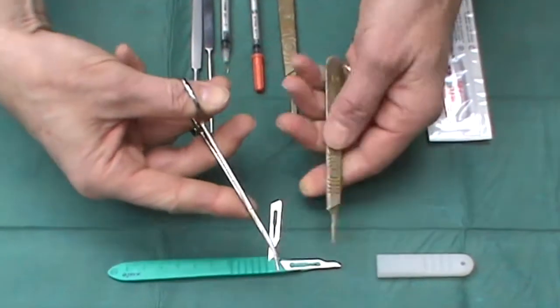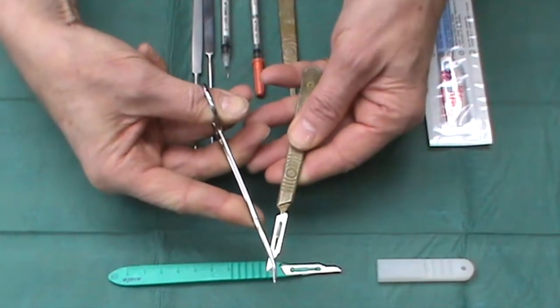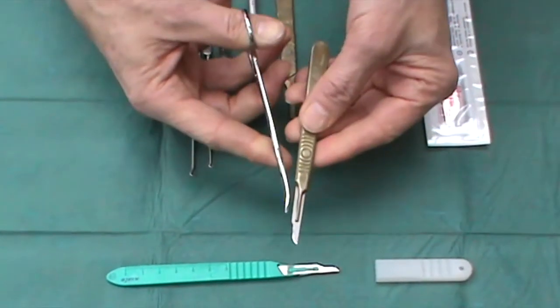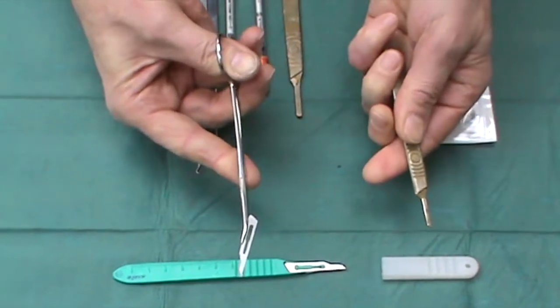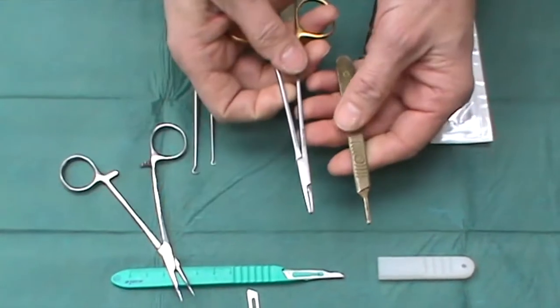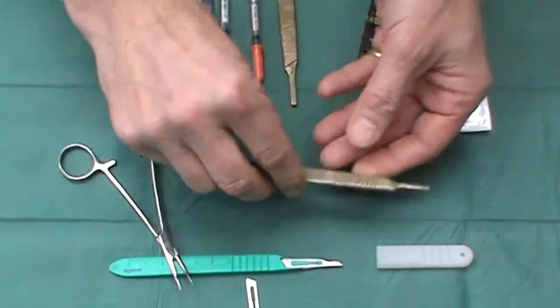The idea here is always to insert the blade onto the handle without harming yourself or anyone else. This is the way I teach people to insert them on, so that it's clicked on, and then to remove, simply apply and pull in that way — and off it comes, into the sharps waste. What you do not want to use is your fine, beautiful suture holders for putting needles on and off.